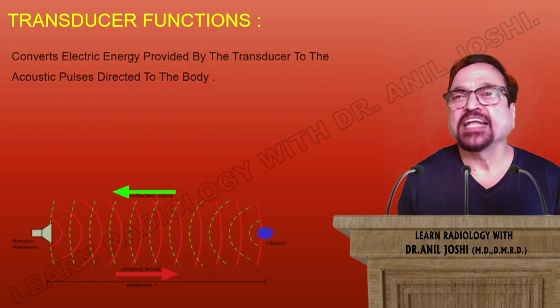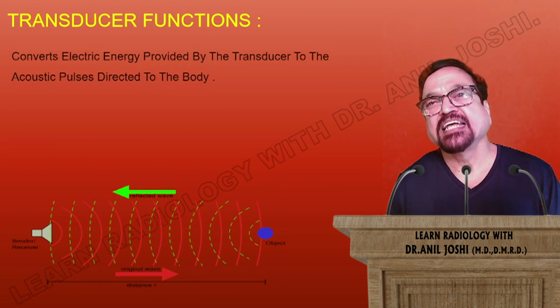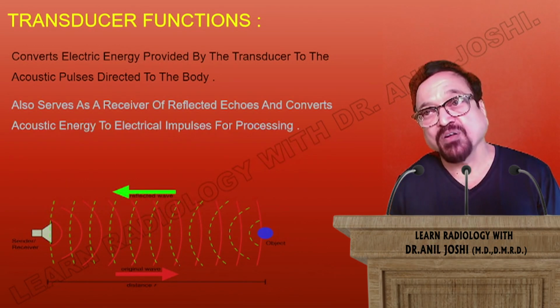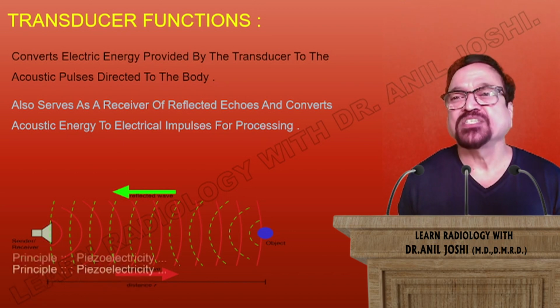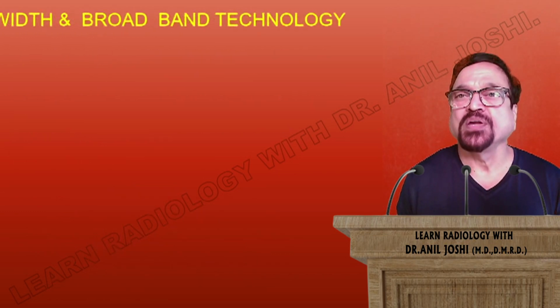The transducer converts electric energy provided by the machine into acoustic pulses directed to the body, and also serves as a receiver of the reflected echoes and converts acoustic energy to electrical impulses for processing. This is on the principle of the piezoelectric effect.